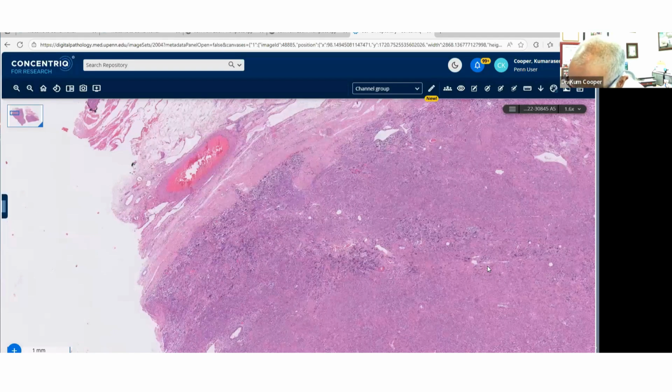There is a solitary fibrous tumor, so CD34 comes in there as well. So we're covering two tumors in our differential diagnosis. And if you're thinking of SFT, and if you do have STAT6, I would encourage you to do that because that is useful in assessing a solitary fibrous tumor, together with CD34. There are rare cases which have a variation in the immunohistochemistry, so it's best to do both.